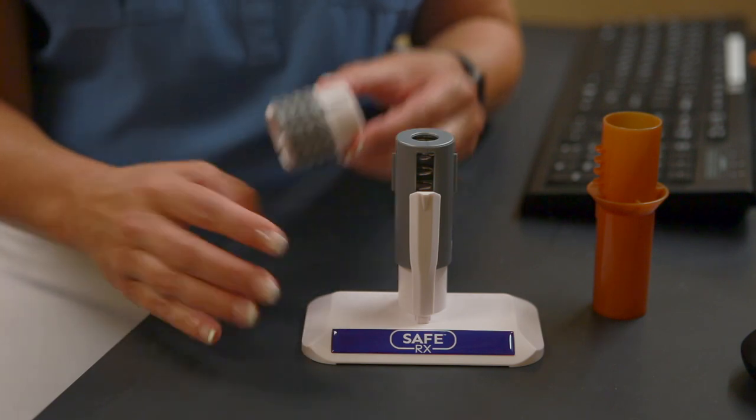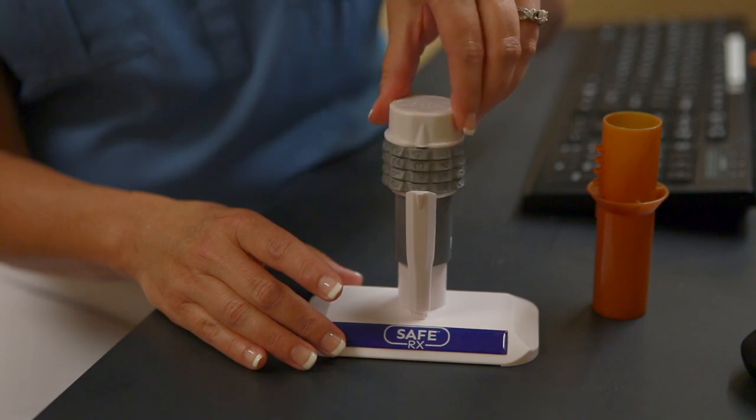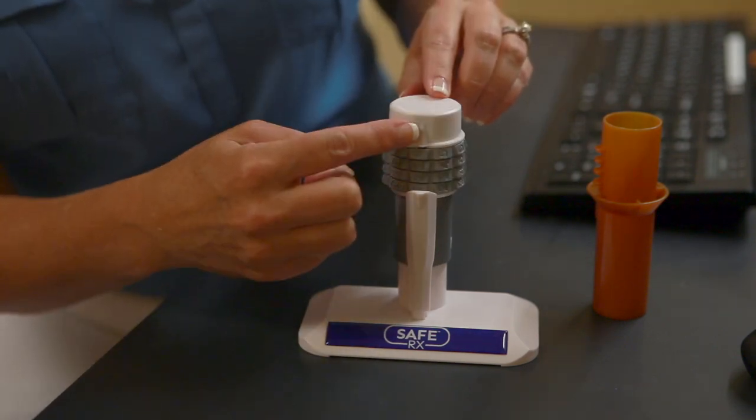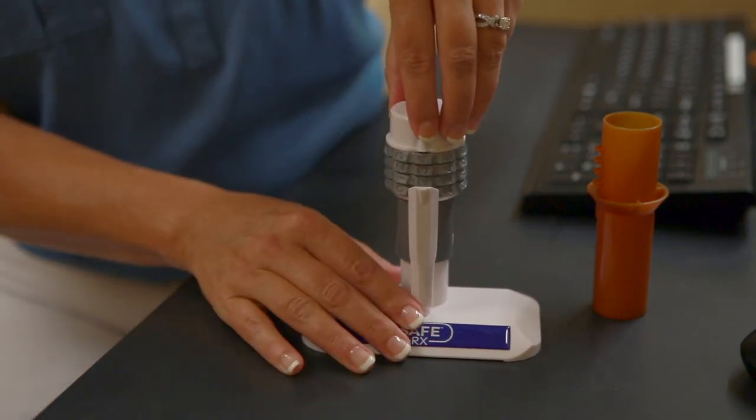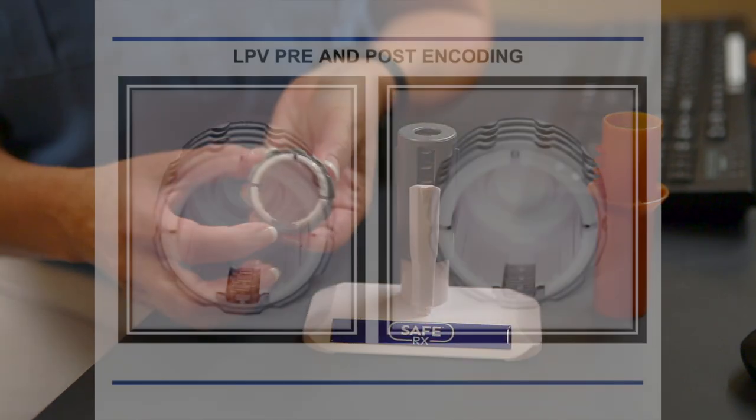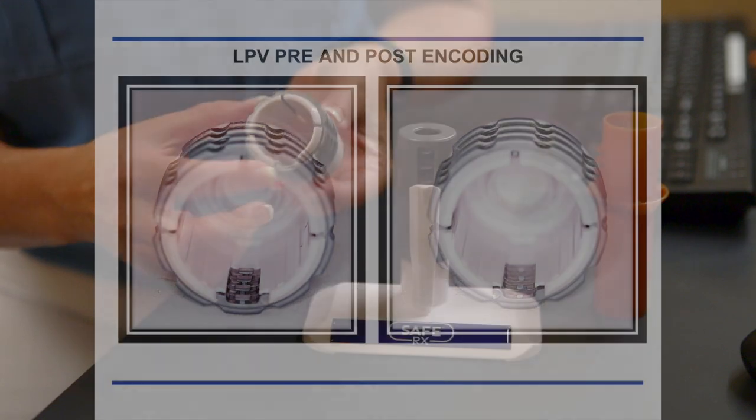The next thing you want to do is take your cap and put it onto the encoding machine lined up arrow to arrow. Then firmly push down — that's what sets the code into the cap, and you'll see the engagement tabs are no longer here on the cap.